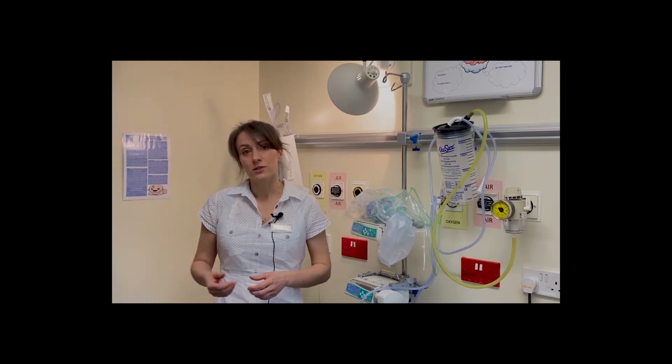stump. Then you want to make sure that you've given your bleep to somebody else so that you're not interrupted during the procedure. And finally, if you're able to, discuss the procedure with the parents to give them an opportunity to ask any questions and be aware of any risks such as thrombosis and sepsis.